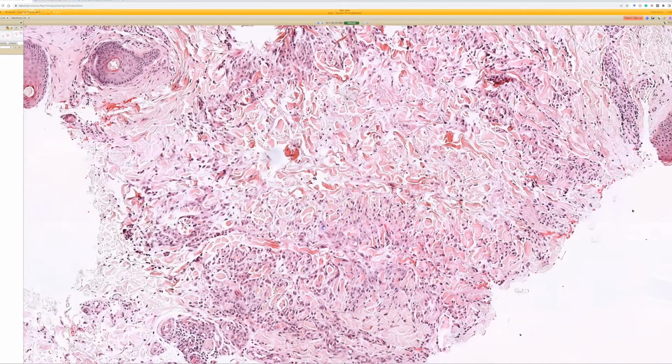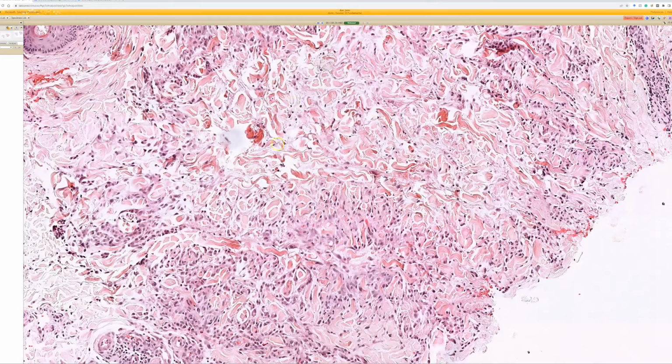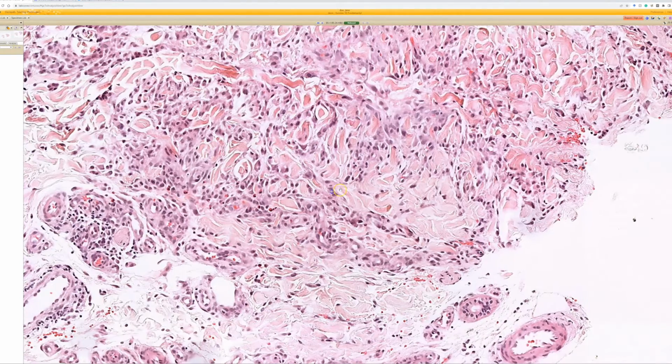Back to granuloma annulare. The histiocytes here form vague aggregates around the edge of the necrobiotic collagen and mucin, and then they trickle and intercalate between dermal collagen bundles, kind of wrapping around and entrapping these pink dermal collagen bundles. That's a pretty common classic finding that is almost always present in GA in my experience.